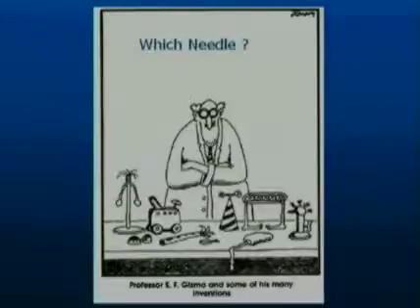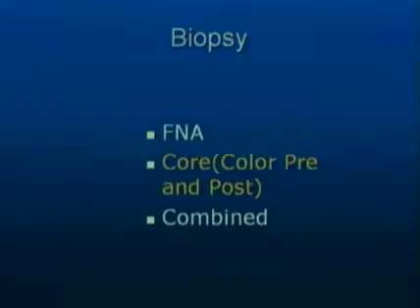At our institution, often cost really trumps everything. So we may decide that we like one type of biopsy device, but because of cost, we go ahead and select another type of biopsy device, which will work very well. Again, core, pre and post color.